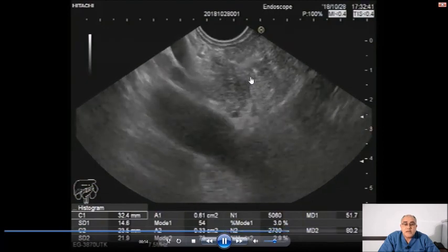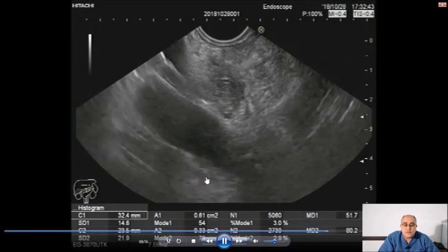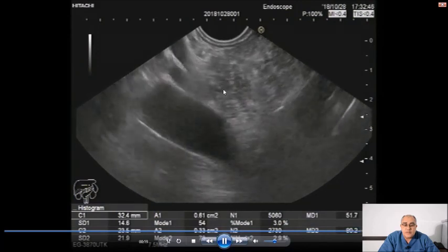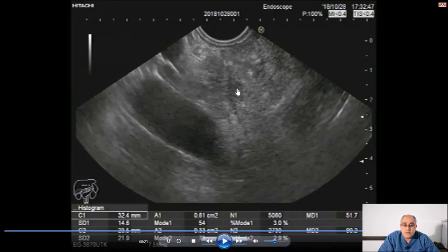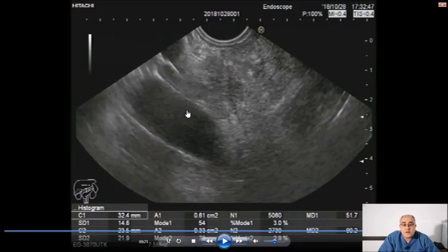This part of the pancreas at this side is the uncinate process of the pancreas. We can also see it from station four, from the stomach just below the cardia. So during our examination, we can see the uncinate process of the pancreas in station one, in the deep second part of the duodenum, and again from station four when we go to the stomach.